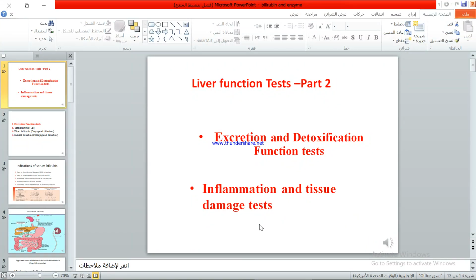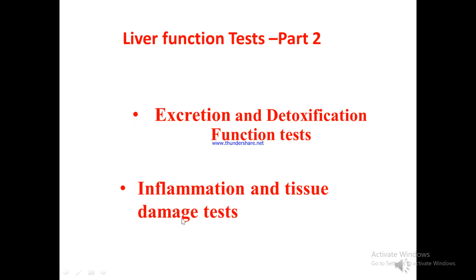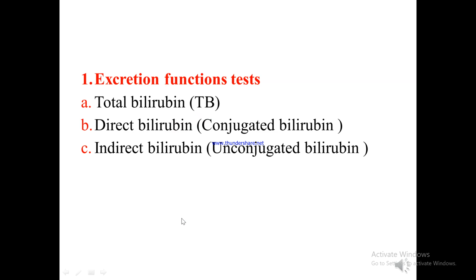السلام عليكم طلاب. إن شاء الله حنكمل لكم second part of liver function test, which included liver excretion and detoxification function, inflammation and tissue damage test. Excretion function test تتضمن إن total serum bilirubin, direct bilirubin test, and indirect bilirubin.